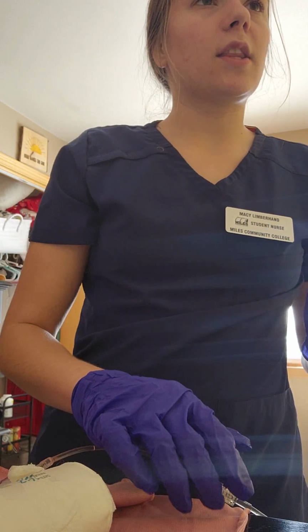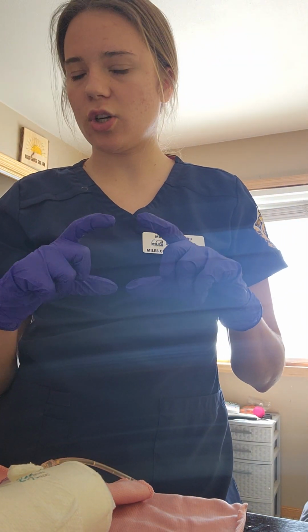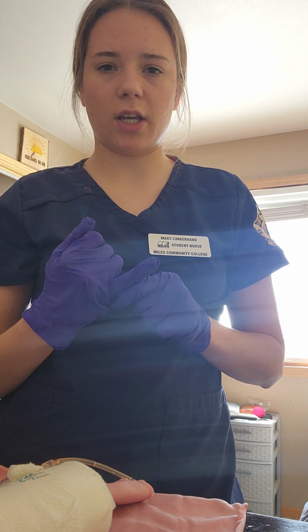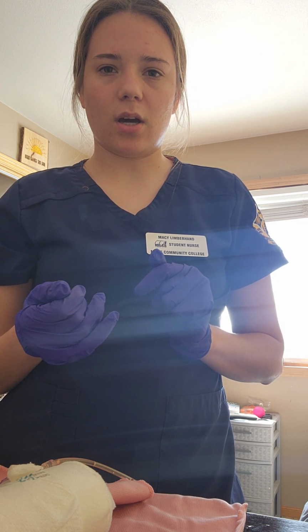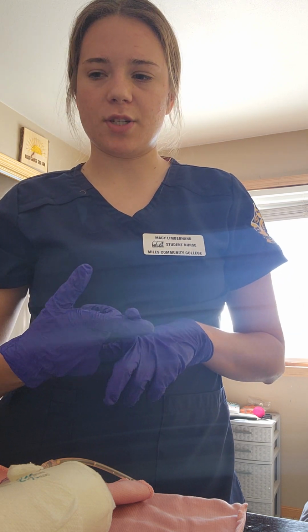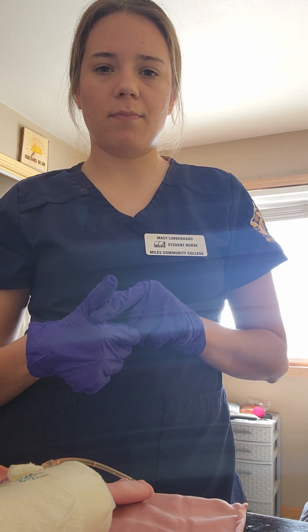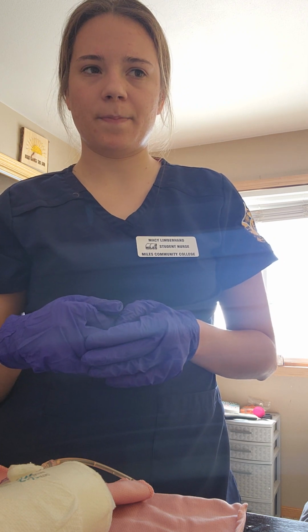Okay, and then when I hang the Piggy Back, I would put a medication card on it, a red one, and I would put the amount of medication that I added to the amount in the bag, the time that it started, which was 1500, the expected time for it to be done, which would be 1545, patient name, date, and my initials.